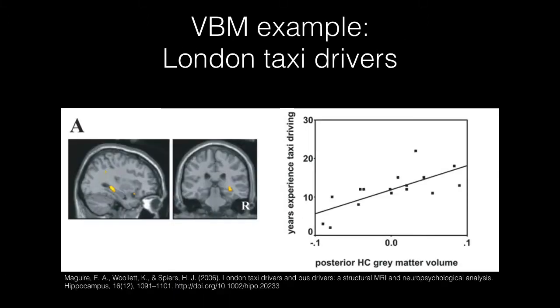This allows investigators to produce a whole brain voxel by voxel map as an answer to questions like, for each voxel in the brain, is there a significant difference between the gray matter of my target participants and the gray matter of my control participants? Or a question like, for each voxel in the brain, how strongly was my treatment group's gray matter signal related to treatment response?